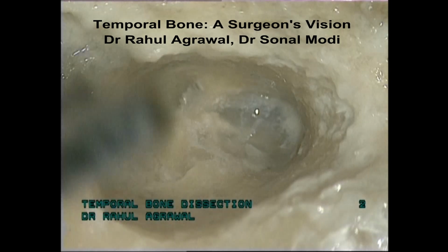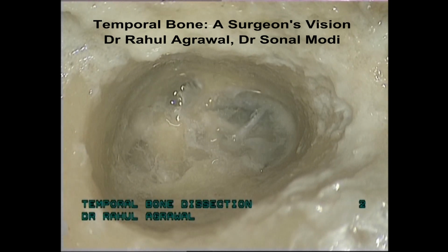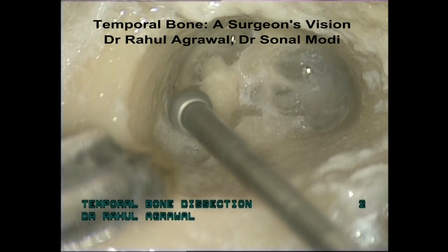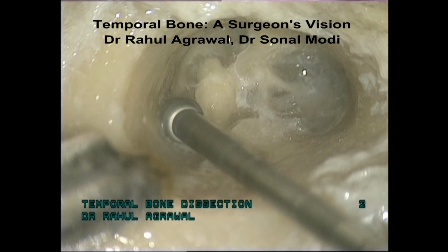Appreciate that my cavity is always circular. The whole canal looks circular. I have reached the antrum, but still the whole canal looks circular.